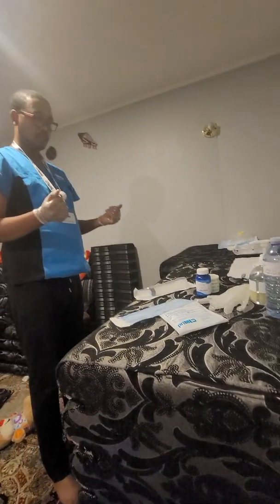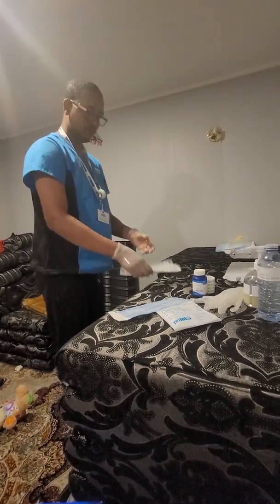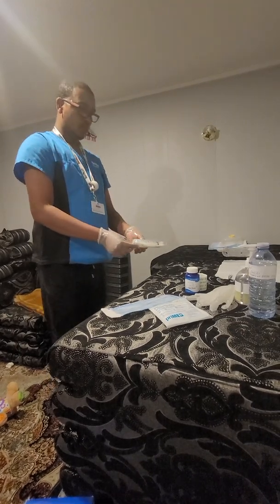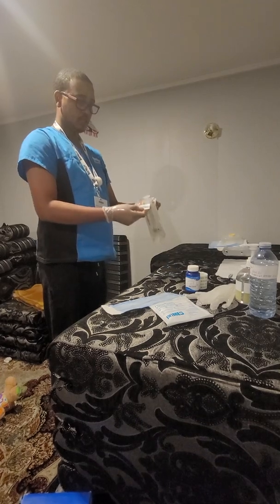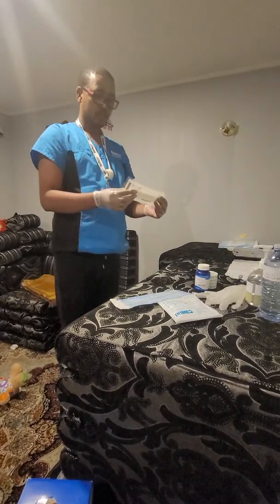So now I can just irrigate the wound. I'm gonna open it. It is not intact, but this is a 50 ml syringe.